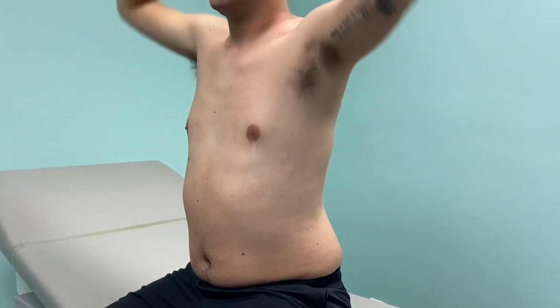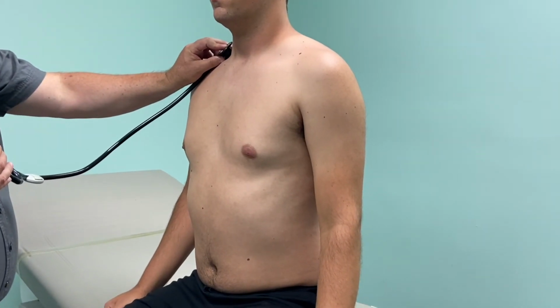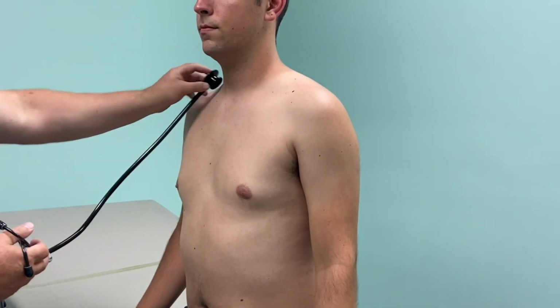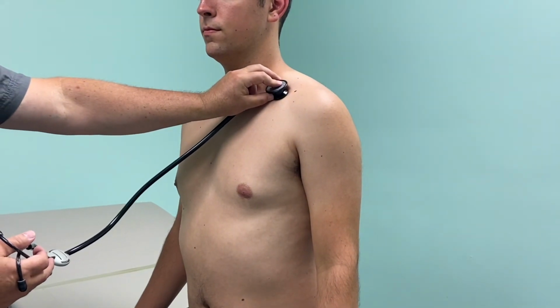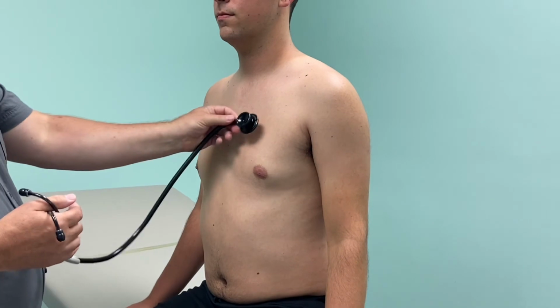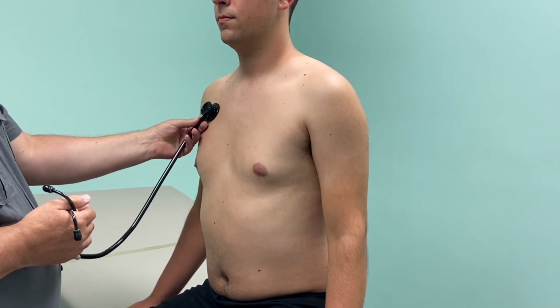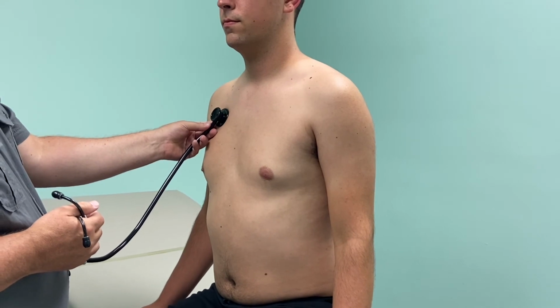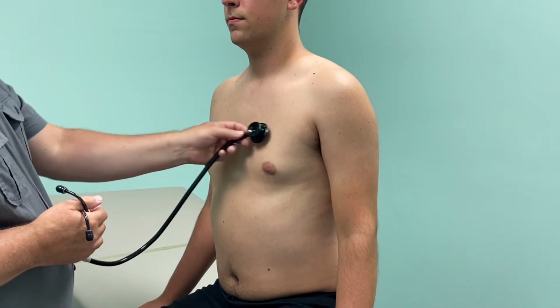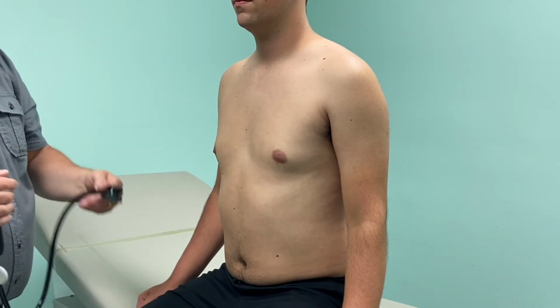Okay, you can lower your arms. You want to listen up at the apex up there. Good. Okay, and then periodically you want to take a break so they don't just keep breathing over and over. But all of the same areas that we percussed, we're going to listen. And again, here, here, here, and here.